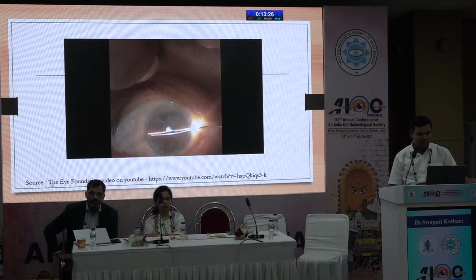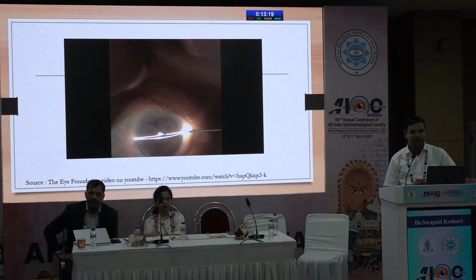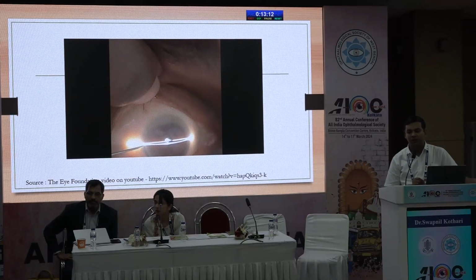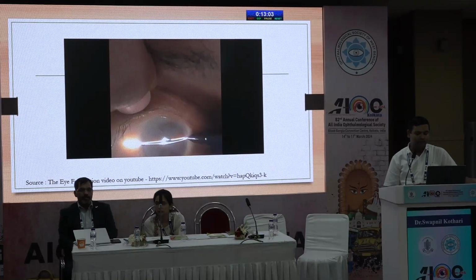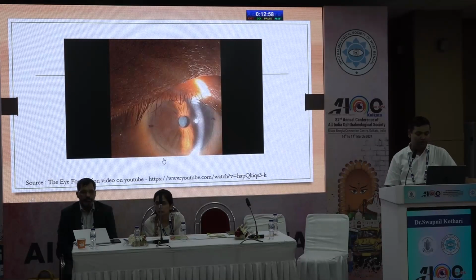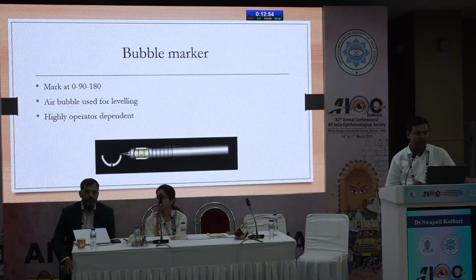And what you can do is use a small 30 gauge or 26 gauge needle to create a small epithelial defect where your slit lamp light is going. You can create a very small thin epithelial defect there, and later on you can use your normal marker pen to mark the slit, so mark the scratch. So that will give you a very good retained marking, and it's a very thin marking, so it will not really cause any problems intraoperatively.